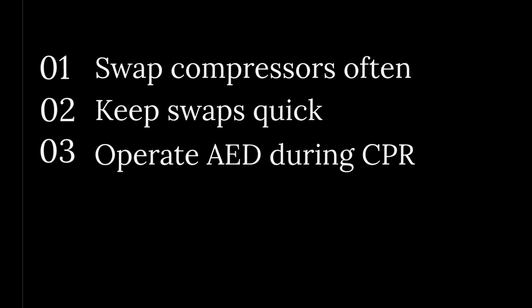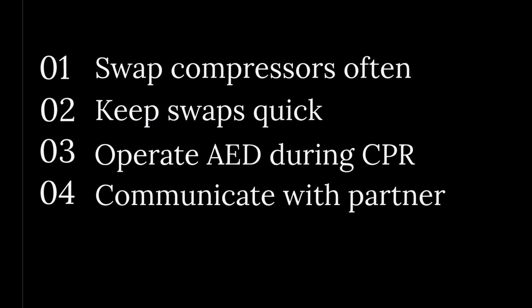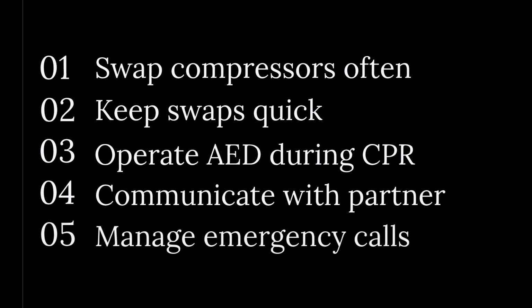Swap compressors every 2 minutes to maintain quality. Minimize pauses during swaps. One person should operate the AED while the other continues CPR. Communicate clearly with your partner. A third person can manage emergency calls.